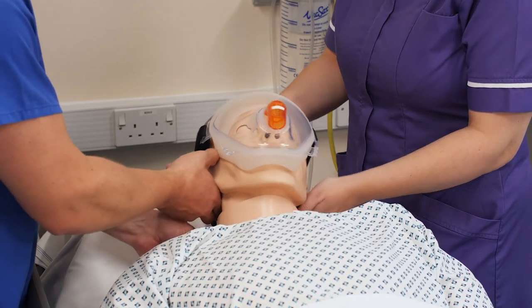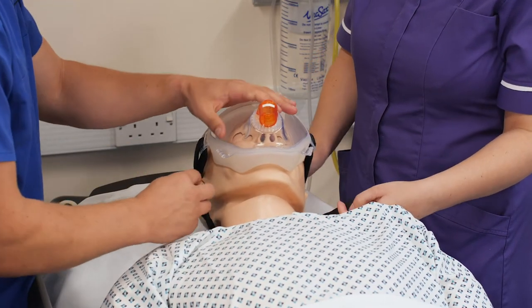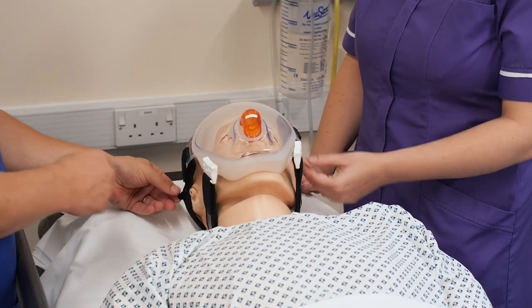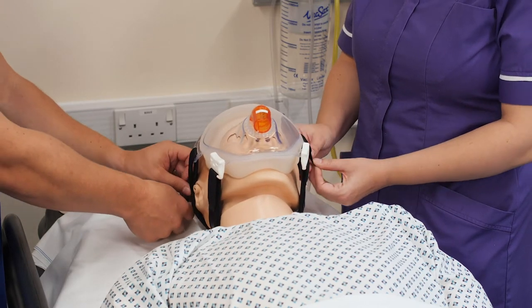Then bring the straps round behind the head, making sure there's no creases in the straps as you bring them round, and you can clip them back in. To tighten the mask and achieve a seal, you then pull each strap evenly to try and make sure there's an even distribution of force across the face.